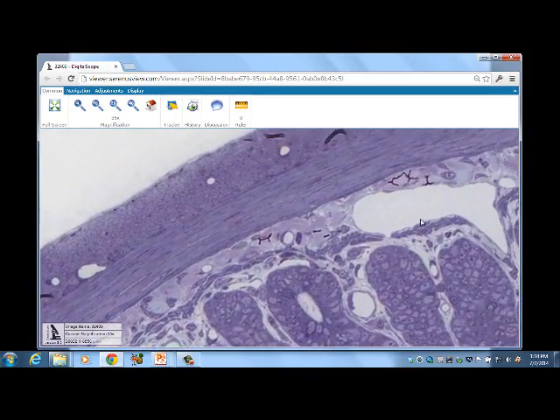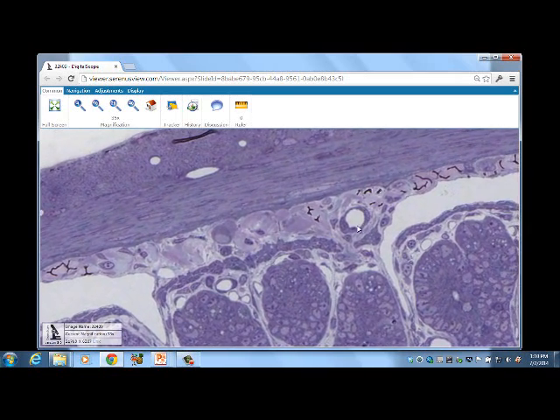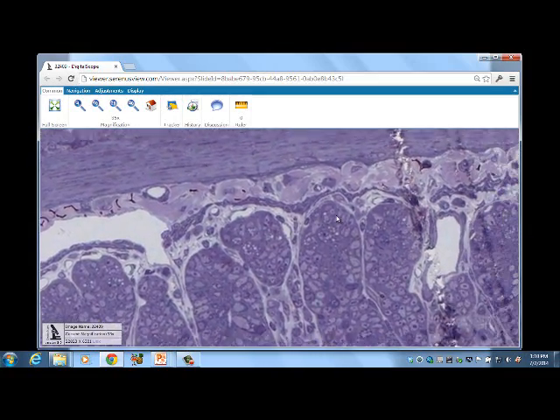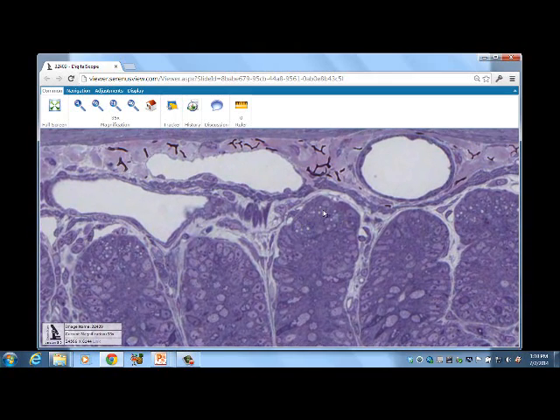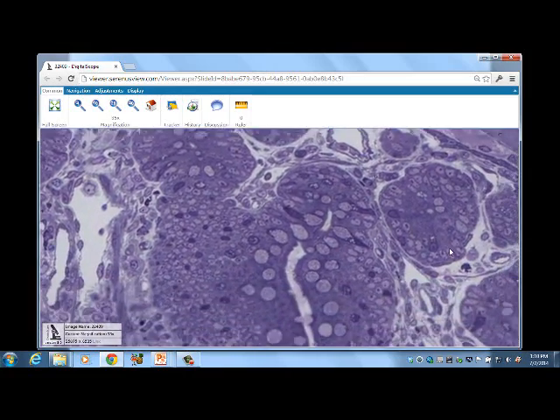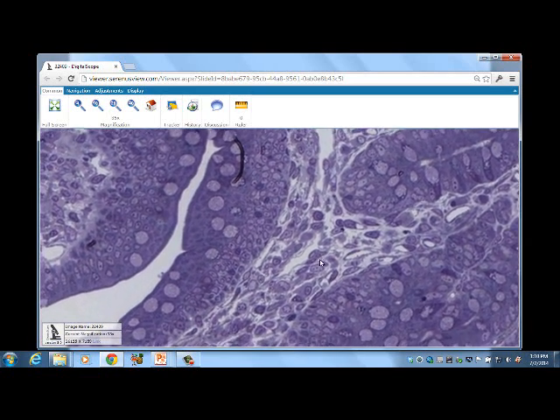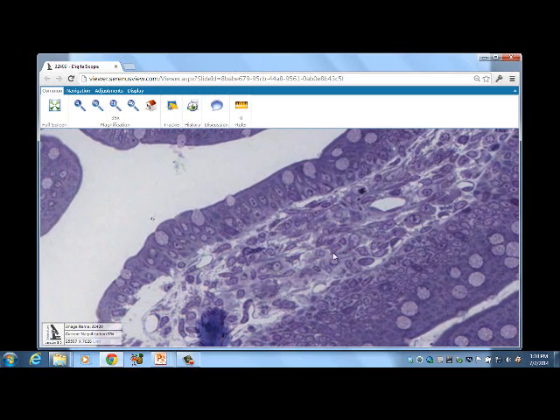So I'm just looking around. These are the endothelial cells that line that. This is a little arteriole that we see there. So this is lymphatics of the central lacteal. There are more Paneth cells in through there that we can see. And then most of the ones are the goblet cells and the intestinal absorptive cells. But here we can see some connective tissue cells that are located in through here, mast cells as well as other cells.